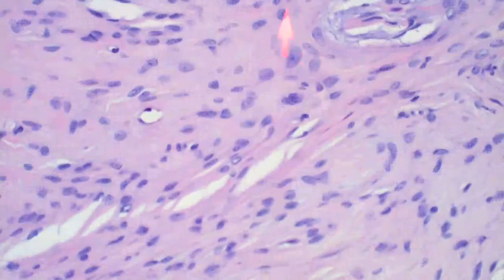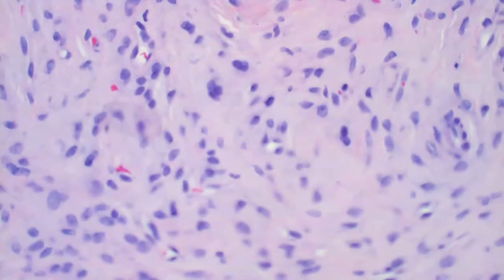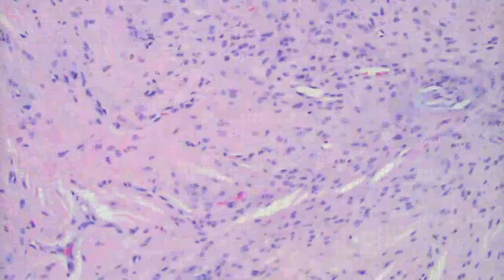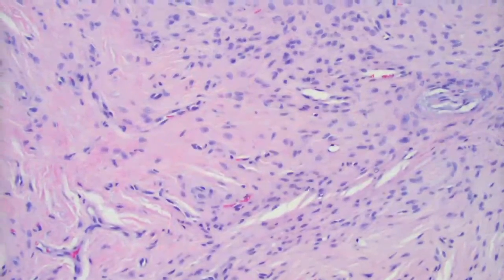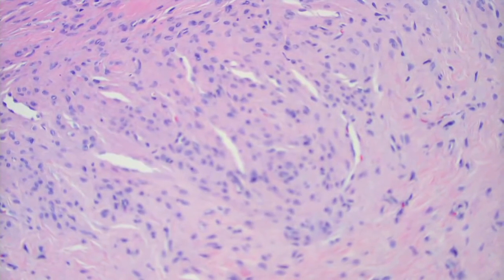Maybe another one right here possibly, but you see how it kind of chokes off any existing nerve twigs that are left. So the perineurium is that little sustentacular sort of connective tissue structure that's around the nerve, and that's what is forming this neoplasm here. So this is going to be S100 protein negative, right? And if you did a neurofilament, you might pick up a couple of these residual nerve twigs in the thing, but largely this is a soft tissue tumor that's related to the lining around the nerve. It's not Schwannian, it's not a Schwann cell tumor. This is a different type of tumor.